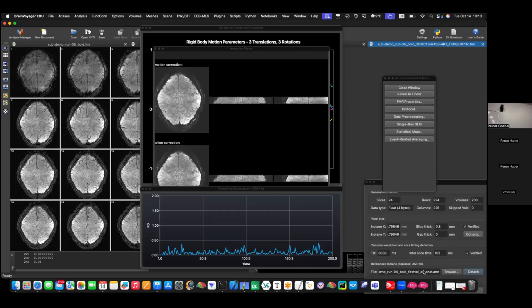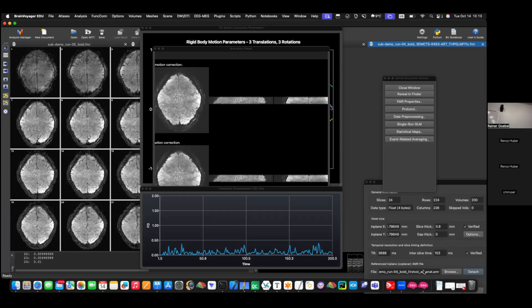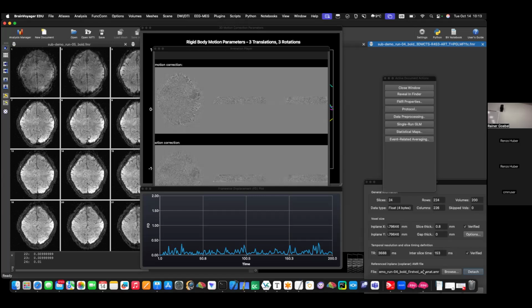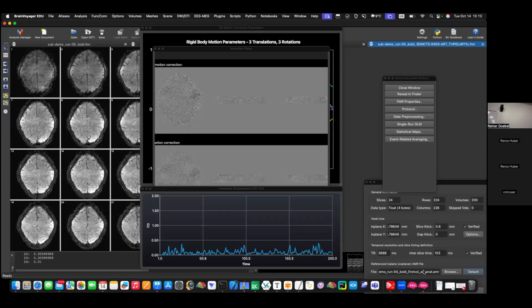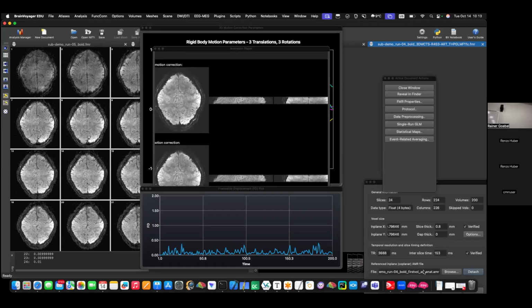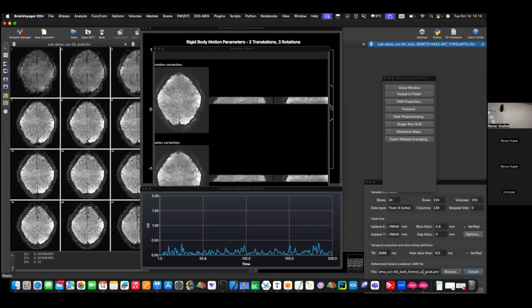But the larger the transformation is, the more, for example, when we do the undistortion correction, the runs which are rotated away, the AP-PA correction will not work perfectly. So you still get some artifacts, because Renzo said yesterday it was recorded run 4, 5, 6-ish. So if we align these 4 runs, the AP to PA distortion correction will work very well, right? And you can then average these 4 runs because the paradigm is the same, the protocol is the same in the 4 runs. That's one of the files I gave you prepared.